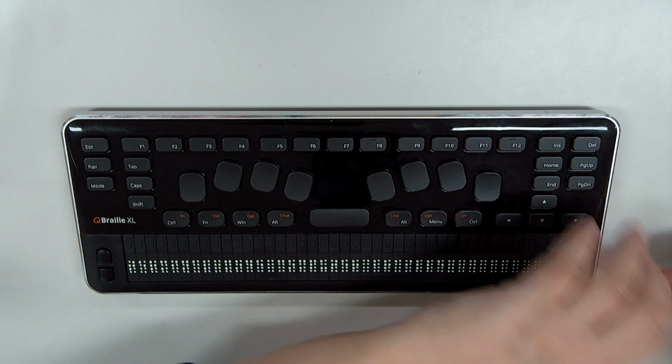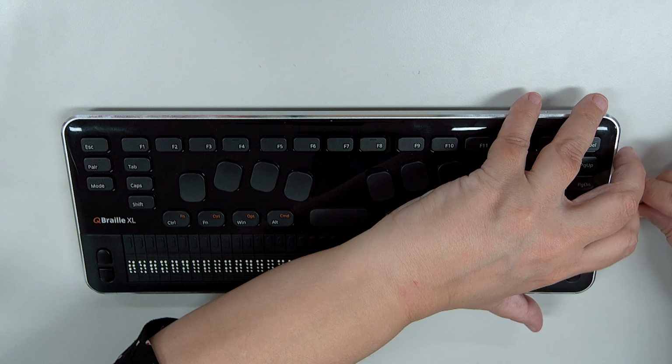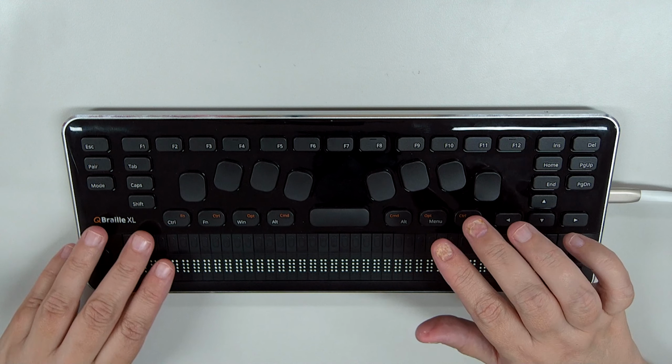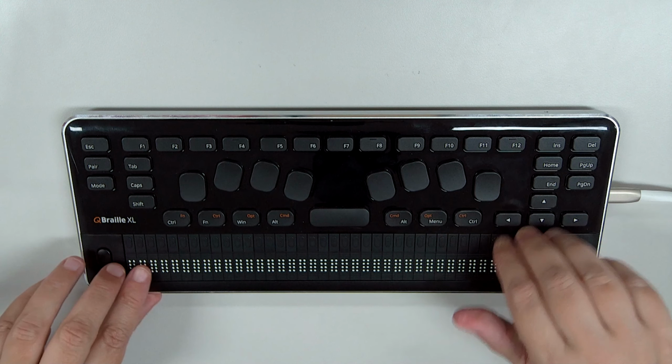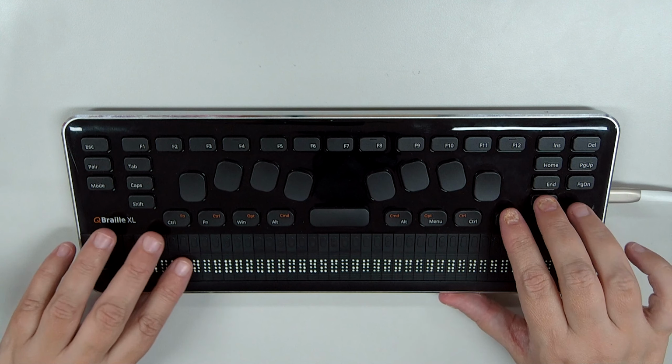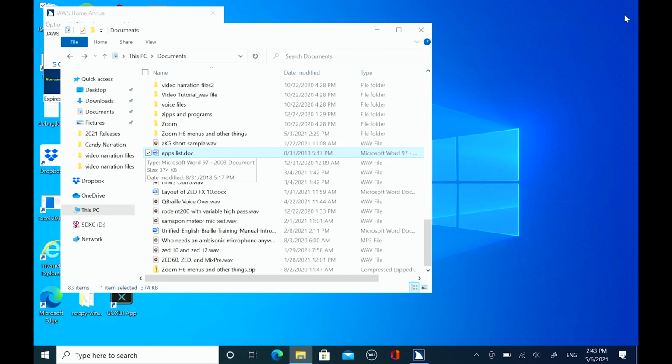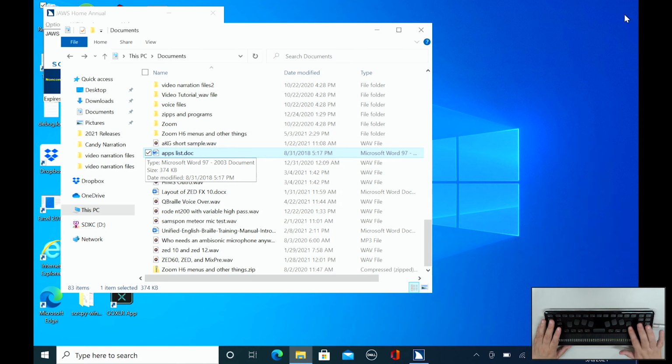Once I'm in terminal mode, I can then connect to my PC. I already have the other end of this cable connected to the PC. And now you can hear things happening. And checked 71 of 83. As I use the arrow keys, things are now happening on my PC. So I'm actually going to open this document. So I'll press Enter here.